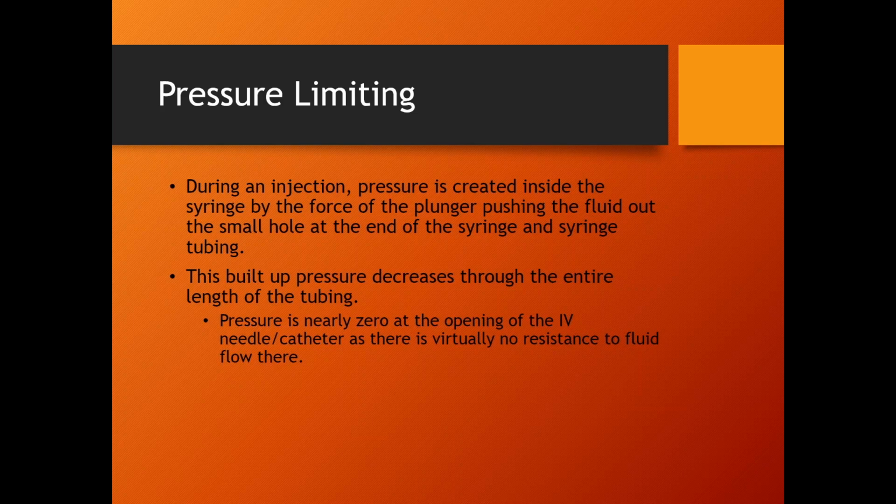Angio injectors are a little bit different. The pressure limit will be higher because angio injectors can shoot higher flow rates. I don't want to get too much into the weeds, but in angio there are all different lengths and sizes of catheters. The catheter determines what the pressure limit needs to be, because that's the weak link. That's what we don't want rupturing. So for angio injectors, there is not one standard pressure. It changes every shot based on the catheter they're using.